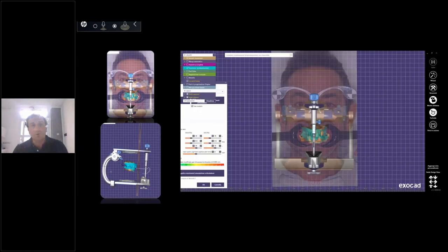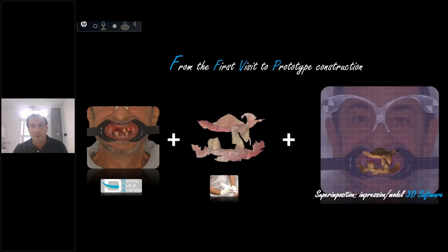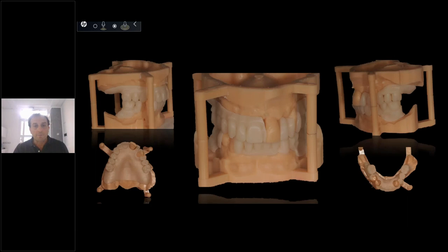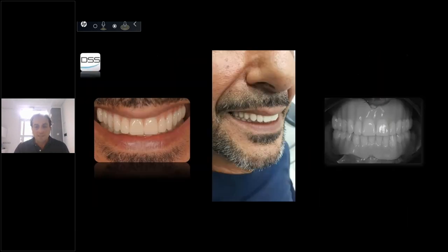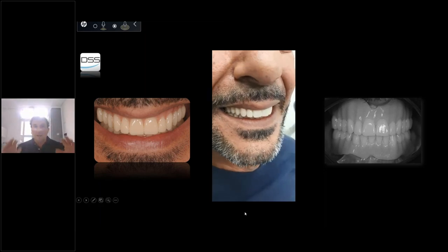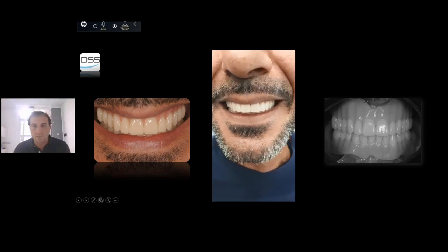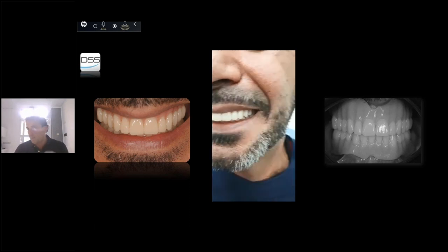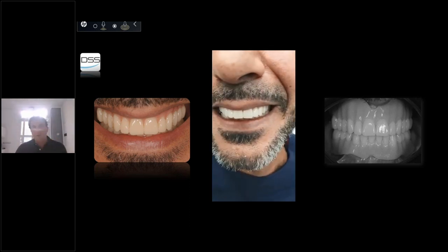I want to share with you this last part, and I finish. This is a prototype for the patient, okay? These are two prostheses, two temporaries. When I have these two temporaries for this patient, it's very important to check the occlusion with data.